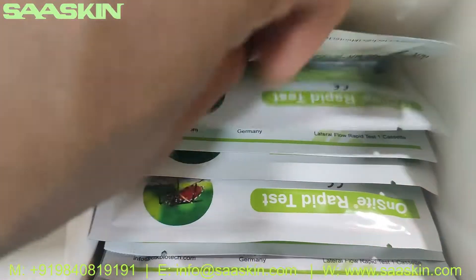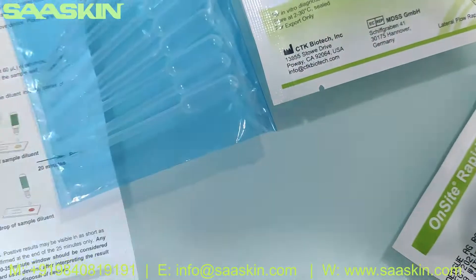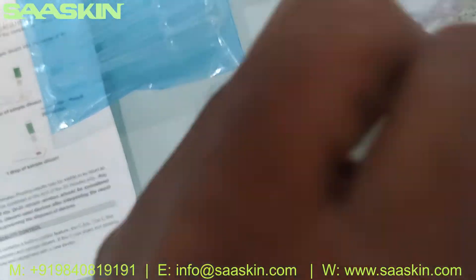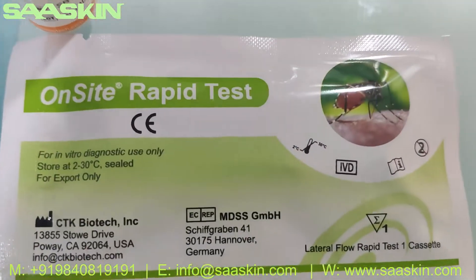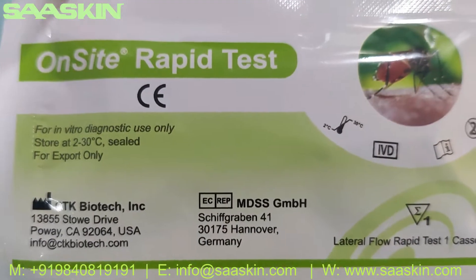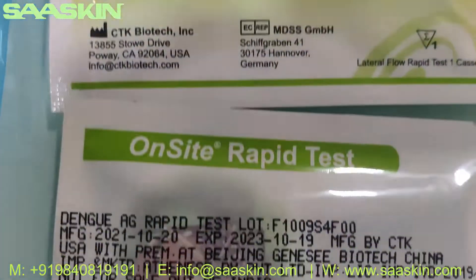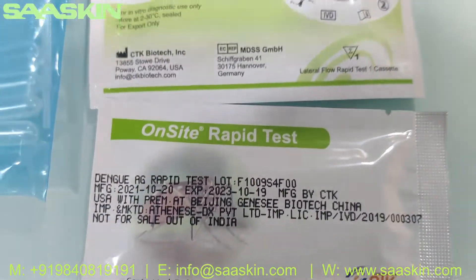Inside you can see the test cassettes — this is the test kit box, you have 10 test cassettes here. These are what the test kits look like. It is from CTK Biotech US, a CE certified product. On the other side of the cassette you have a 2-year expiry period for these kits.